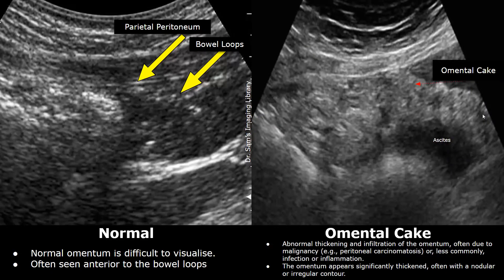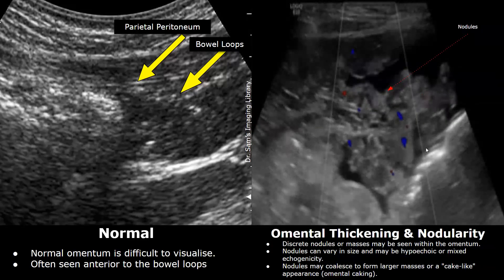Ascitic fluid is present. In this image, the omentum has many hyperechoic nodules of varying sizes. Discrete nodules or masses may be seen within the omentum, giving it a heterogeneous appearance overall.